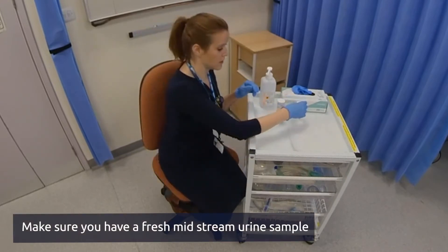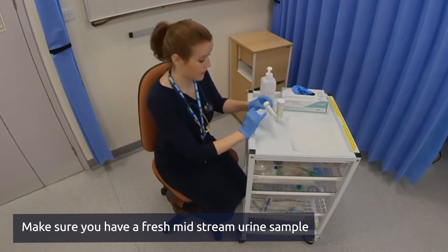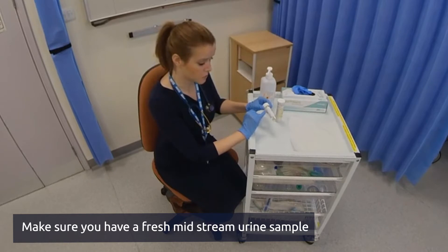You want to take your urine sample and double check the name — which is Peter Clarke on this one — the hospital number, and the date of birth.